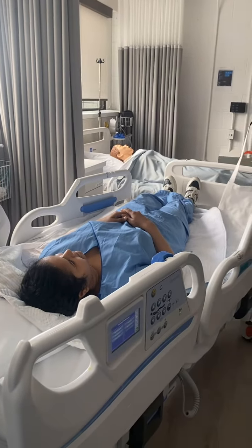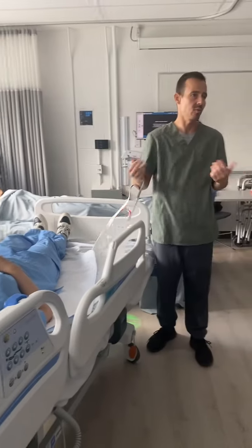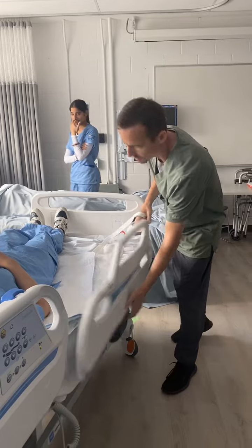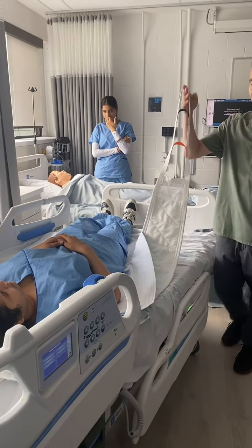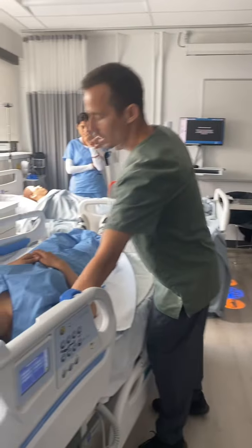Now, in this case, we only have 2 hooks on either side. Like I said, there are slings with 3 or 4. Essentially, you need to attach all of the hooks. If you attach the hooks to that square bar like this, what's going to happen to the patient?